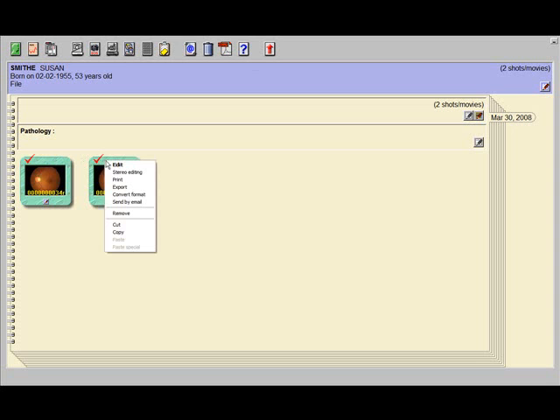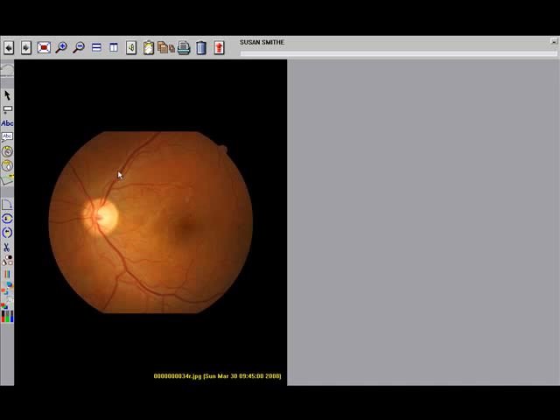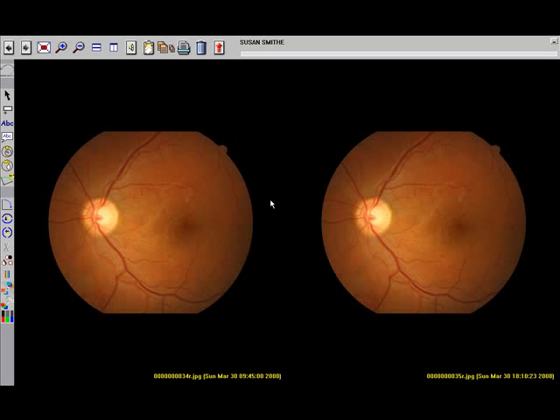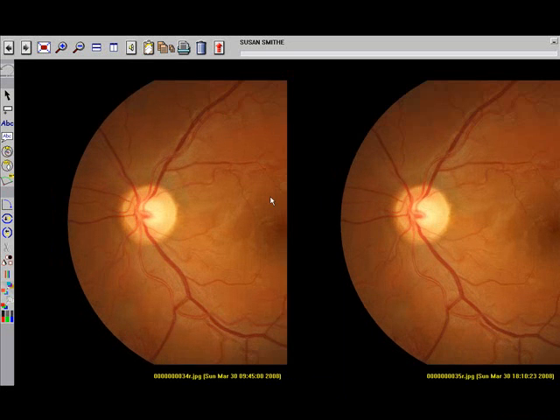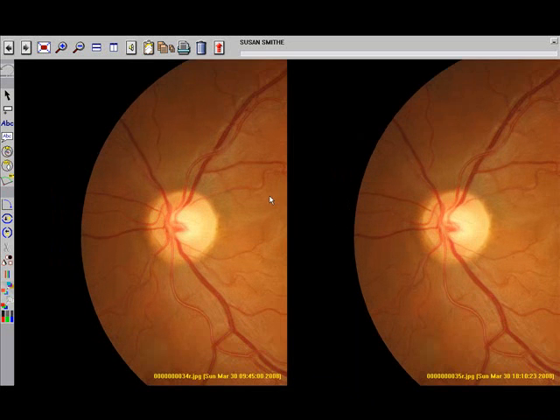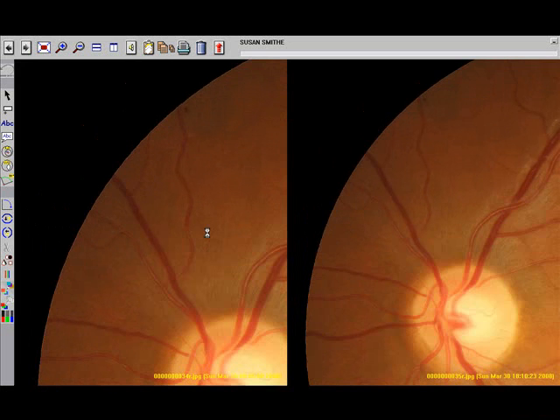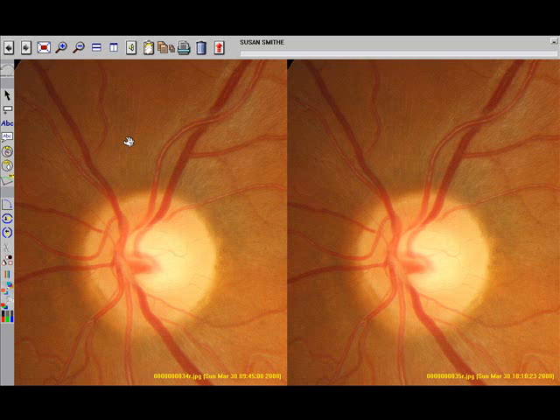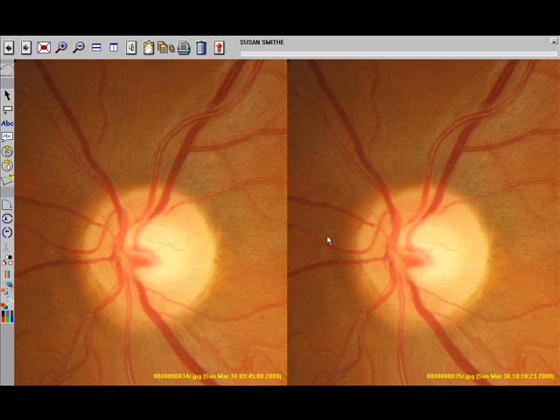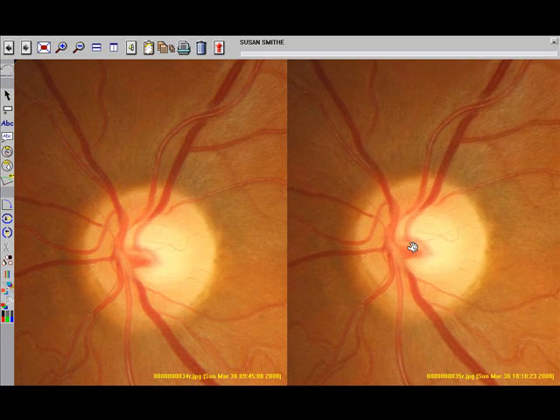Left-click on Stereo Editing. You can then use the wheel on your mouse to scroll the images up, and then left-click and hold to adjust them. If you wish to save these images as a stereo pair, you'll need to hold the Shift key down to adjust the images so they are at the same height.